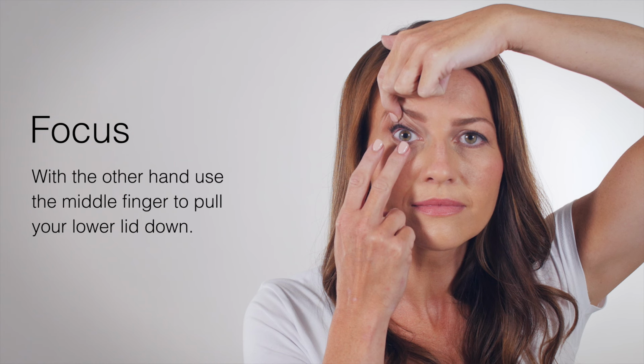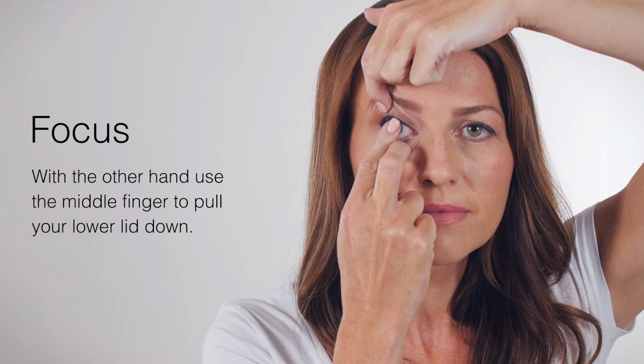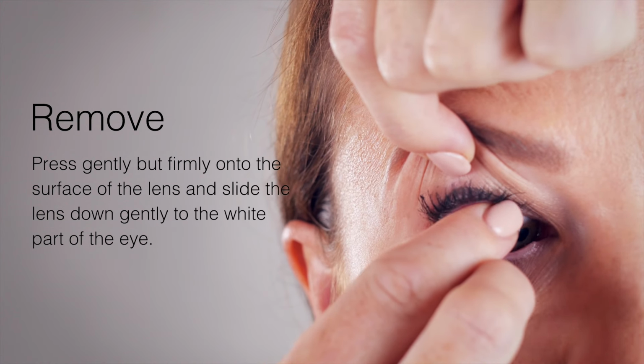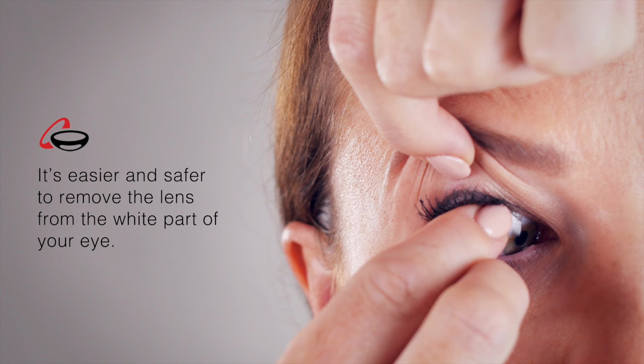Lower your chin slightly and look up into the mirror. Looking straight ahead, bring your index finger towards the lens. Press gently but firmly onto the surface of the lens and slide the lens down gently to the white part of your eye. It's easier and safer to remove the lens from the white part of your eye.